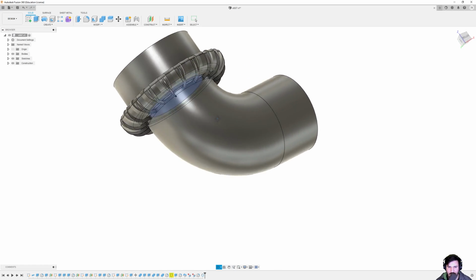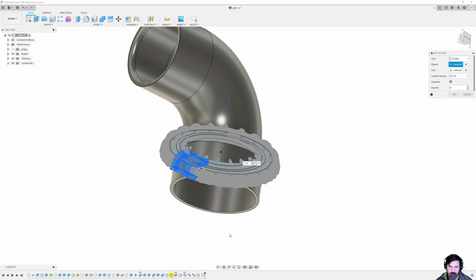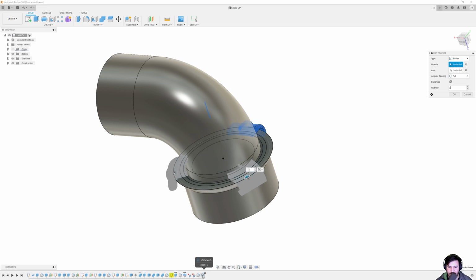It also would cause the slicer probably to die because that is a lot of intersections with itself. But basically, instead of just copy and pasting it or rebuilding it on the other side of the same specs, this allows you to easily change things up. And if I step back in the timeline, I don't have to change it in 2 spots. I can change whatever I need right here, and then when it gets circular patterned around, it just changes on all of them.